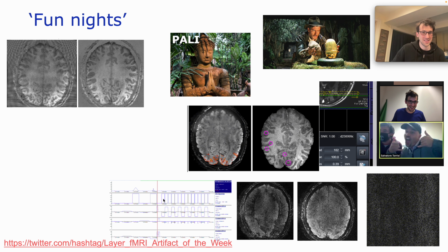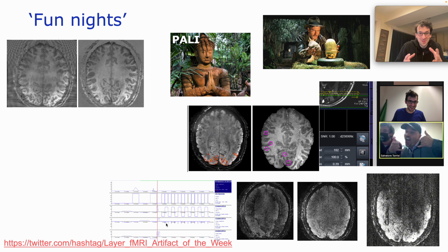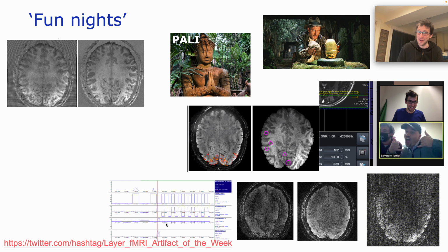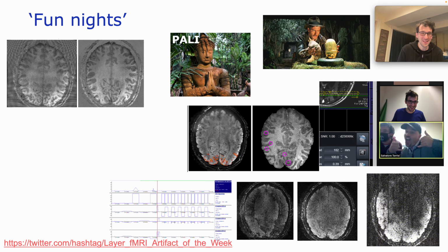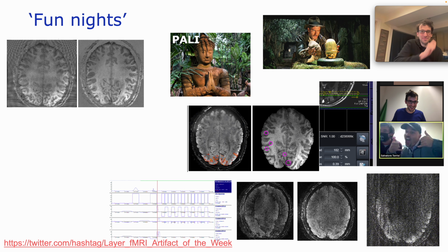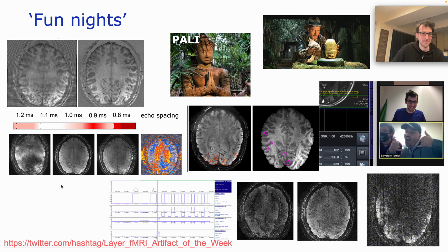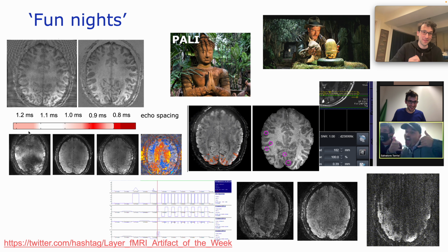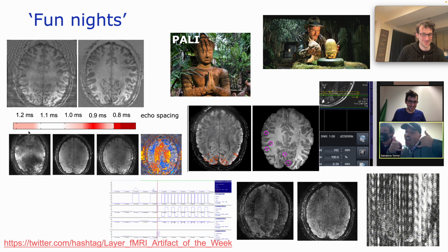Suddenly these crushers and rephaser blips became a problem because they conventionally use the maximum slew rate, and it's just overkill to use 900 slew rate from the Feinbergatron just to make the blips a few nanoseconds shorter, right? So we had to relax them a bit, understand where they're coming from, and then also still optimize a lot with the echo spacing to deal with the different levels of artifacts that you're getting on certain parts of the spectrum.